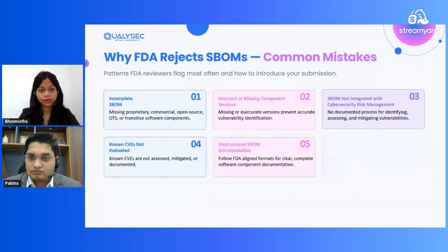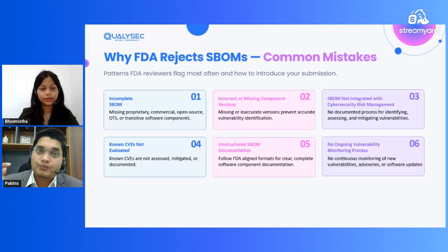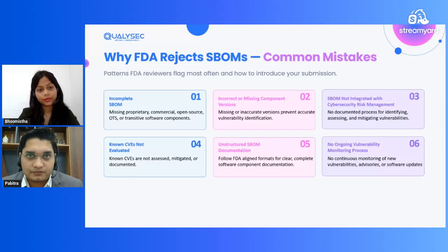And last, it's not something that you create the night before the submission. It's an ongoing vulnerability monitoring process from the start. Whatever components you have used, when you submit, whatever components are there, even for the post market, this ongoing vulnerability monitoring process has to be implemented. It is going to help you in the post market as well.